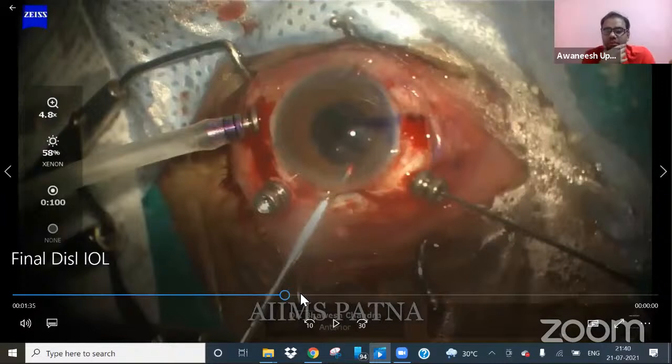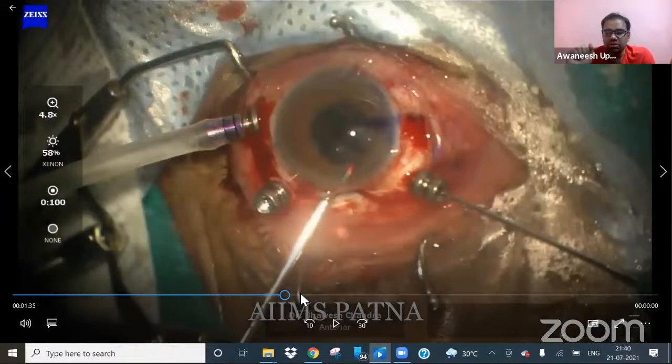So, question, Dr. Prabhu, I think one question when the IOL is actually sitting onto the retina: do you do a thorough vitrectomy, or do you do some core and try to actually maneuver it up? Because sometimes the posterior hyaloid does help.